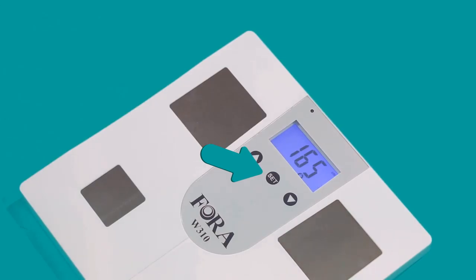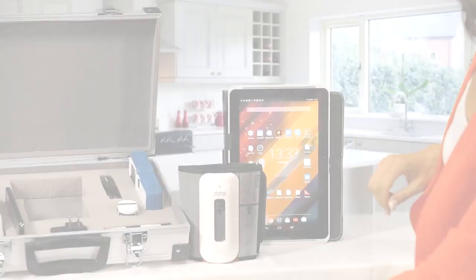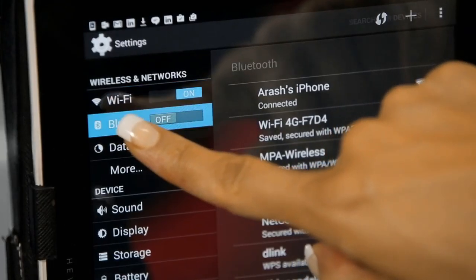Wait for a few seconds until the scale turns off automatically and a blue light starts flashing on the scale. You will then see the letters PCL on the screen. Go to your Bluetooth settings on your tablet or phone.